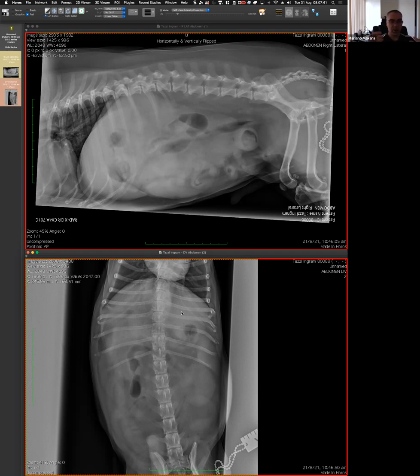Makes sense? So we can bring the description, and I think that usually helps us also see things if we know how we're gonna end up classifying abnormalities.